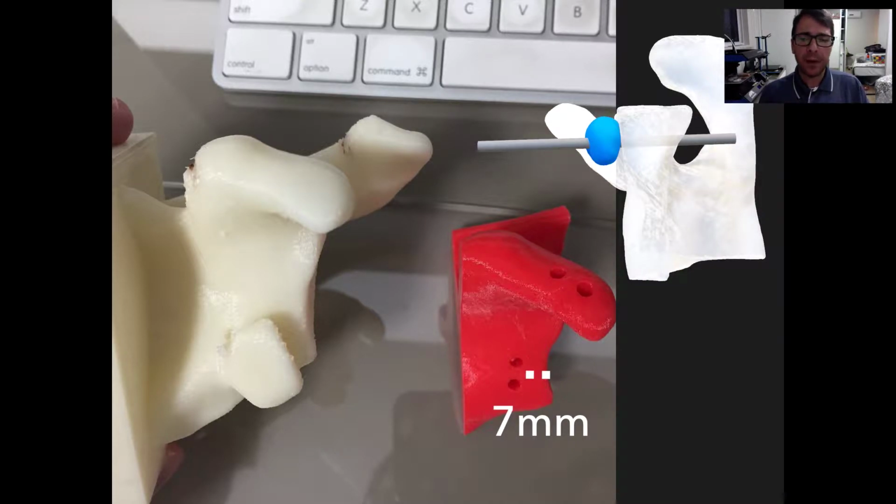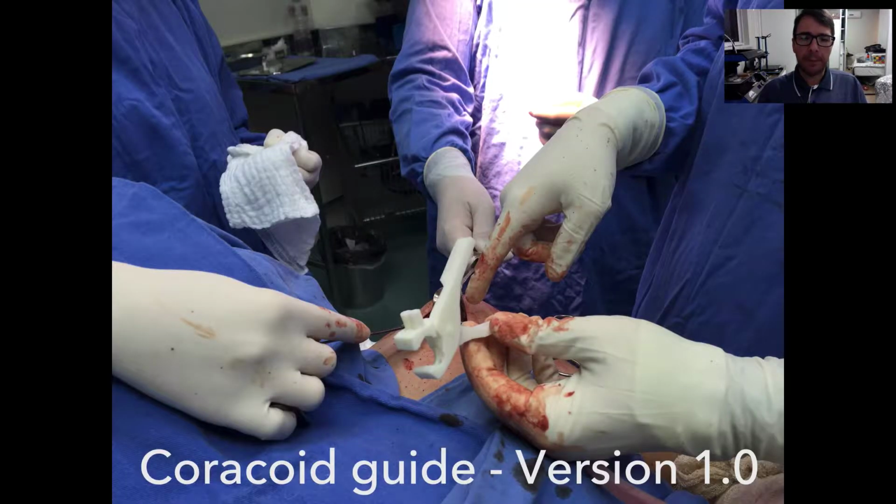Here we have an example of the glenoid that we will encounter with the fragment, and the same glenoid where we have removed the fragment, and we have printed just the location of the two screws, so that we can have this 3D printed model at our operated site, at our surgical field, to replicate our planning.